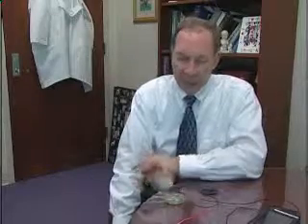And you can take a system like this, and where a muscle may not just be strong enough, or it may not be coordinated enough because it doesn't have a sensory branch or something like that, we'll be able to add a system like this to take a patient with an incomplete recovery and make them more functional than they otherwise would have been. I think systems like this are going to be integral in that regeneration type of strategy.